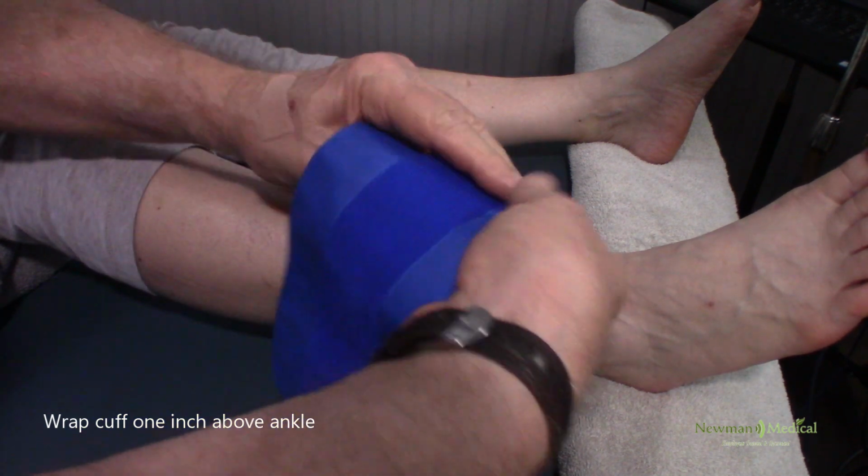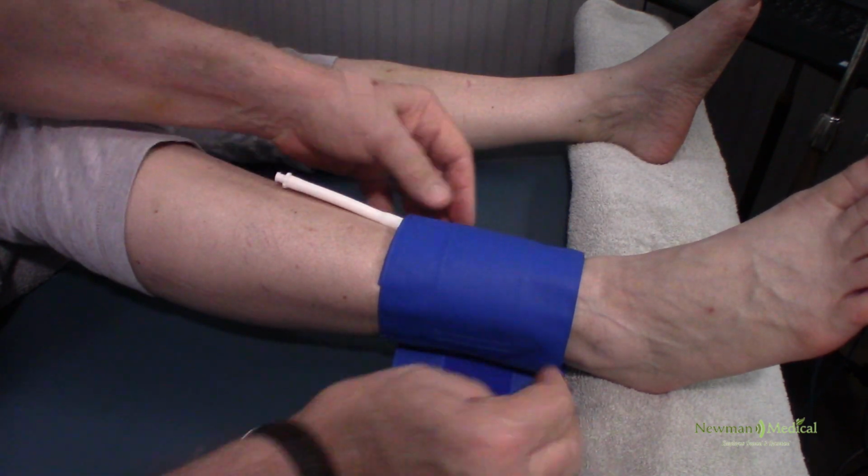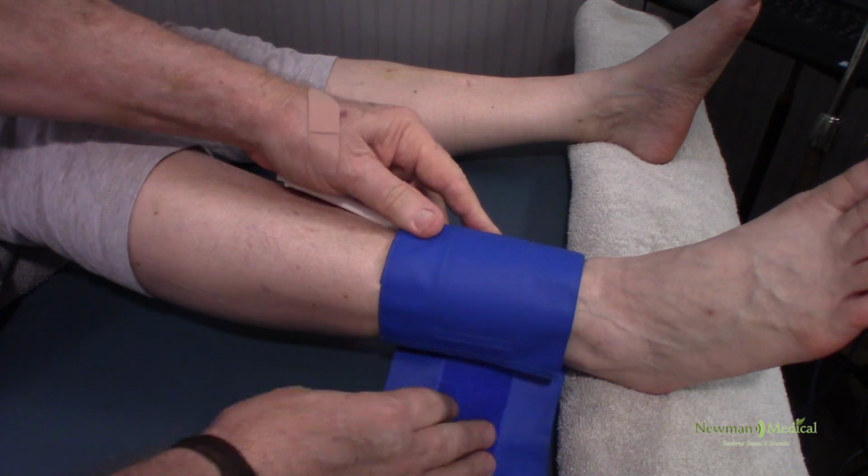When wrapping the cuffs, the patient may try to hold their leg up to help, but ask them not to, because when relaxed the cuff may loosen.